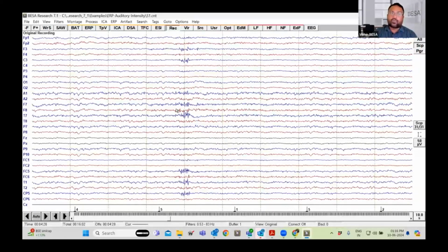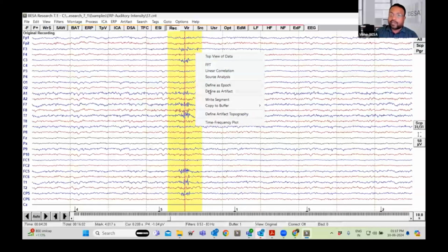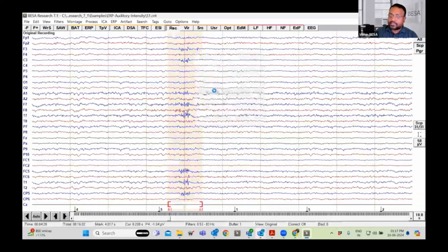Now suppose you are studying the data based on frequency and activity. You know that it is an artifact, and you don't want to include this section in your processing. Then you can just left click that section, keep your cursor in the yellow region, right click it, and define it as an artifact. When you do that, you get these brackets at the bottom saying A1, this is artifact 1.